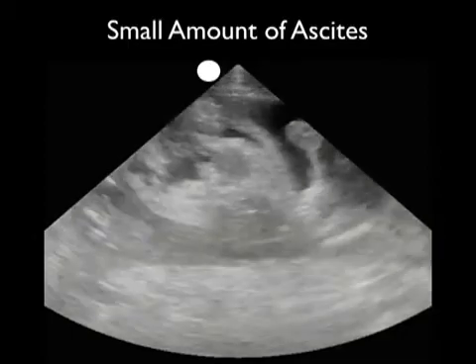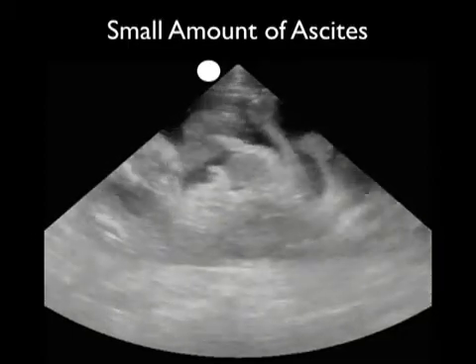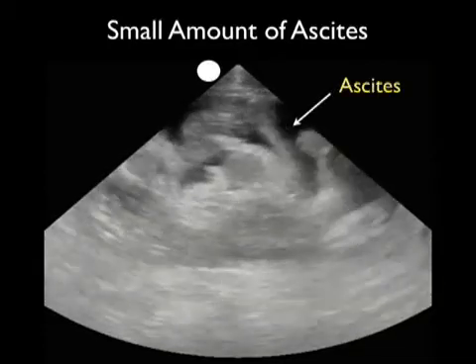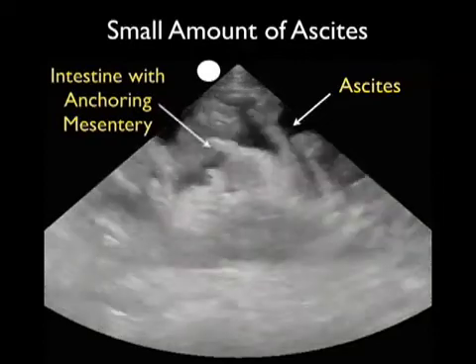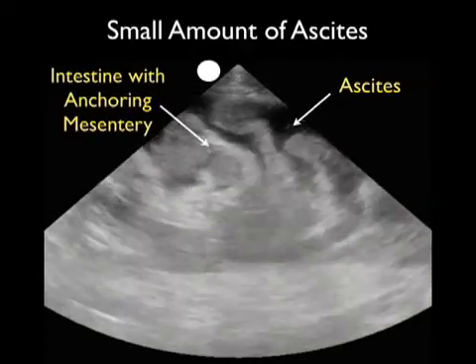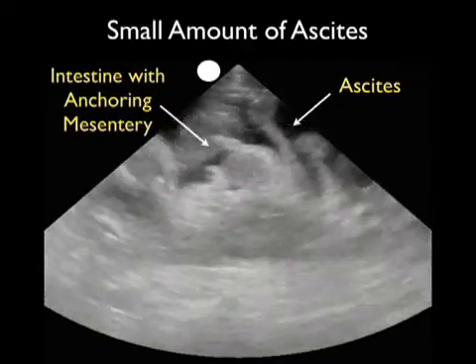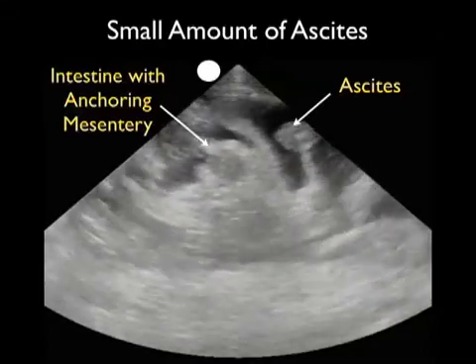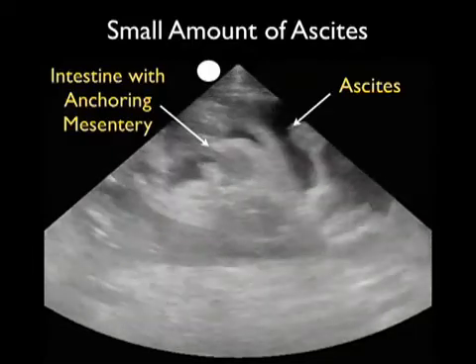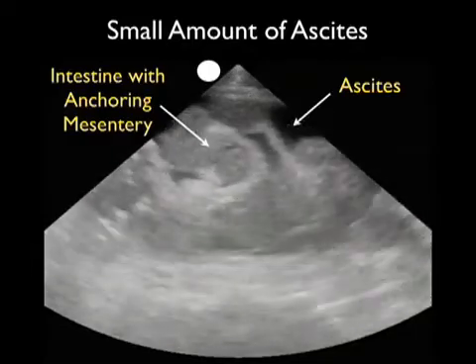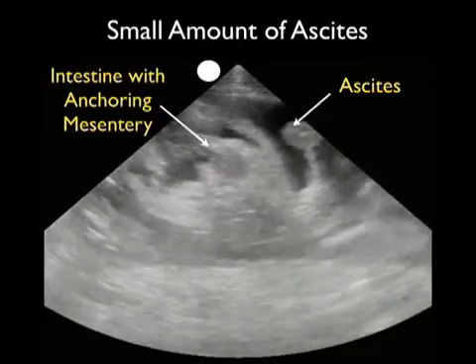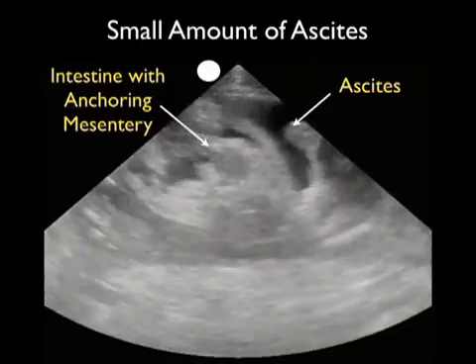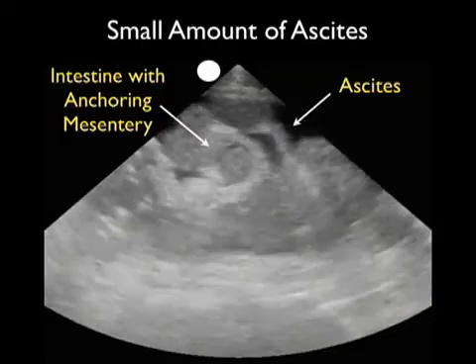This video clip shows a small amount of ascites taken with a 3 MHz probe. We can see the small amount of ascites denoted by that dark or anechoic fluid collection, and we can see the intestine with anchoring mesentery swaying back and forth within the ascites as the patient breathes. This is known as gut sliding, making the intestine look almost like palm trees swaying in a breeze. From this location it might be unsafe to perform a paracentesis, as it could be difficult to get a needle between areas of intestine without puncturing through intestine or mesentery.